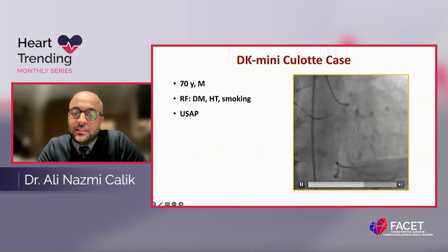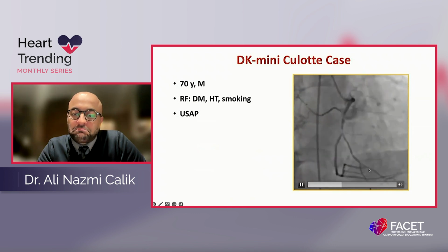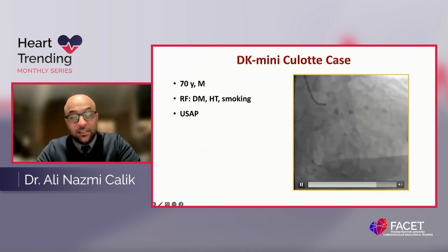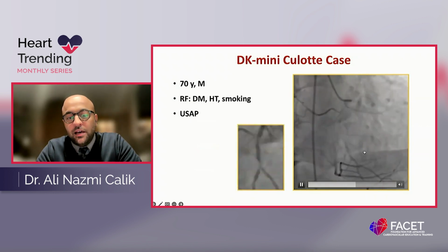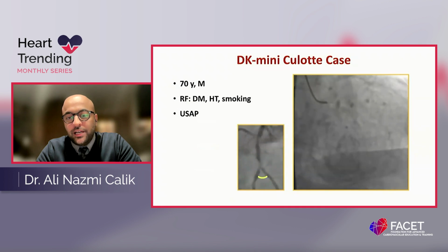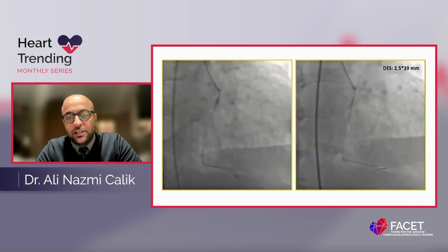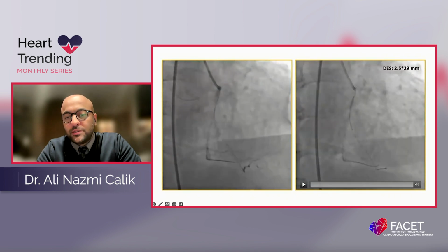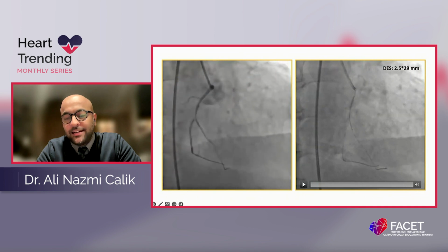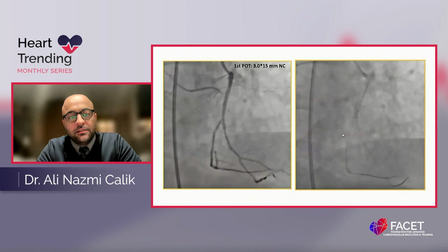You can appreciate a significant stenosis in the proximal RCA, and then a very high takeoff, probably the right ventricular branch, and there is a Medina 111 bifurcation lesion with a narrow angle. So after predilating and preparing each lesion, we first stented by covering the proximal stenosis to the more angled branch, the first stent. And then, of course, the first POT is mandatory.